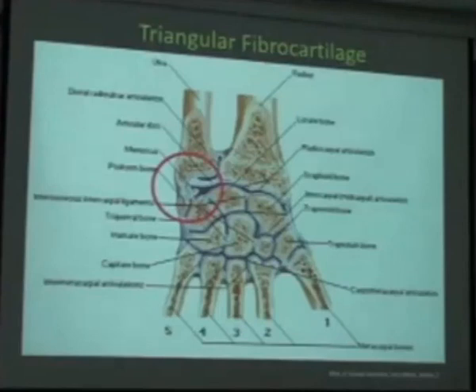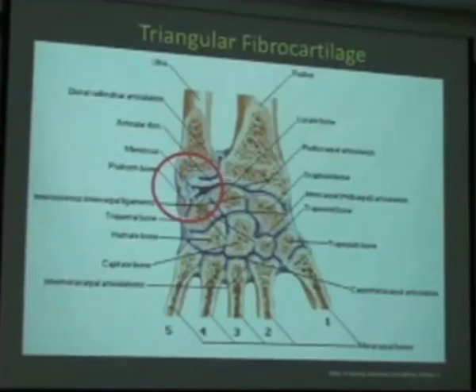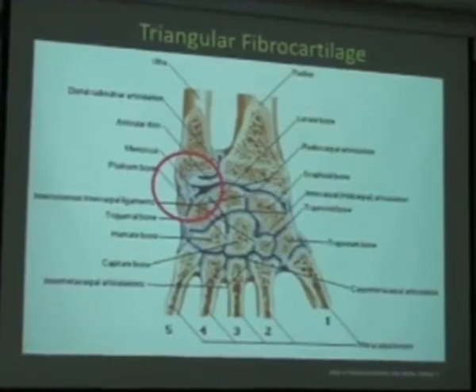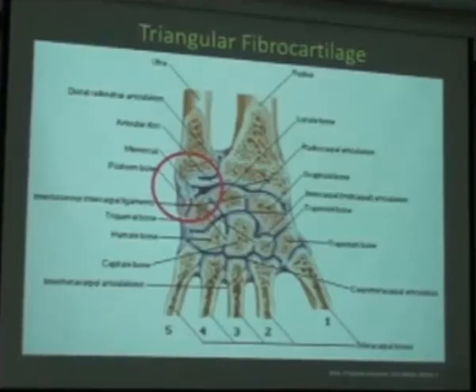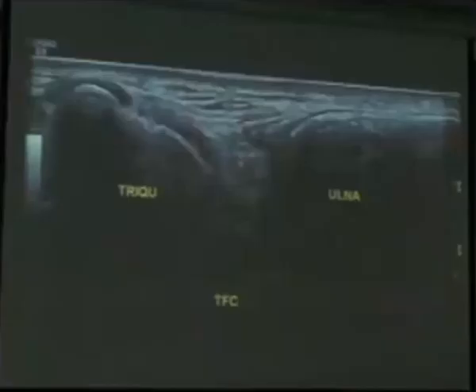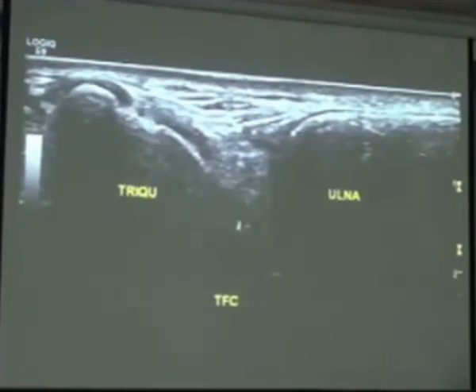Another important structure we can only partially visualize on ultrasound — MRI is much better at the deeper portions — is the triangular fibrocartilage complex. Its main function is to provide stability to the ulnar aspect of the wrist and to absorb mechanical forces due to axial loading, acting like a shock absorber. With ultrasound, we can only really see the superficial aspect of that cartilage, and quite a bit of insufficiency occurs in the deeper part that we can't see, which is where MRI provides better imaging.